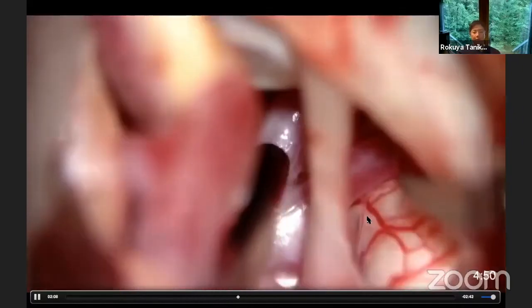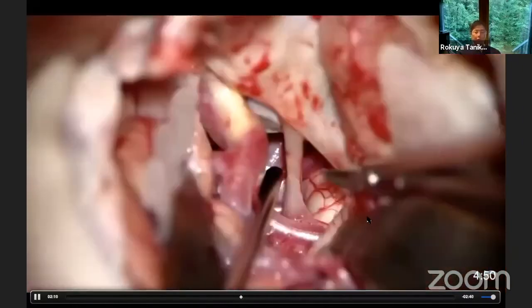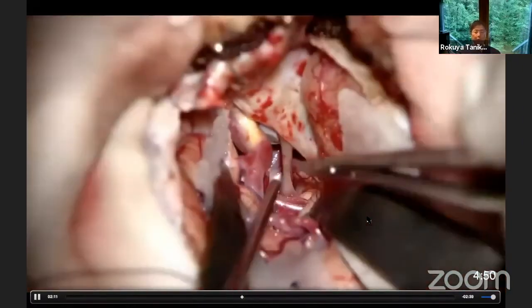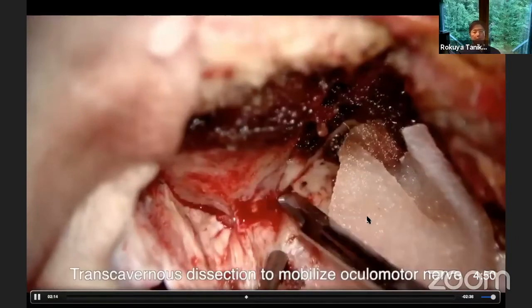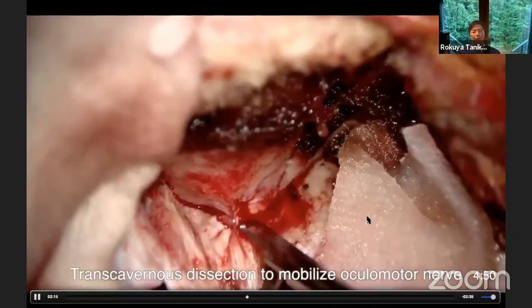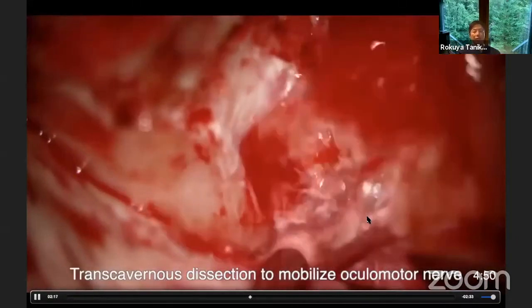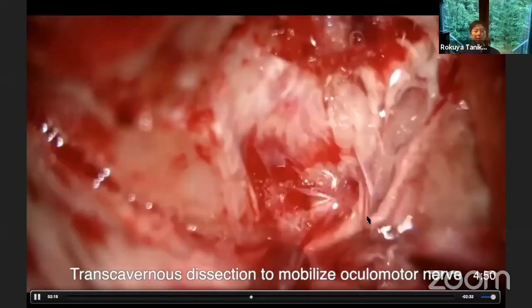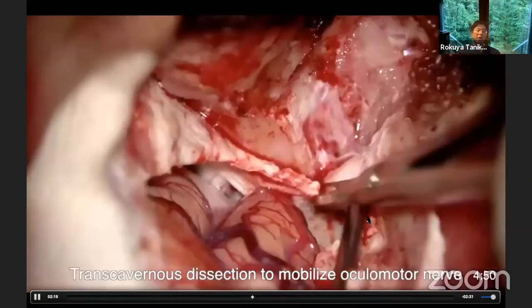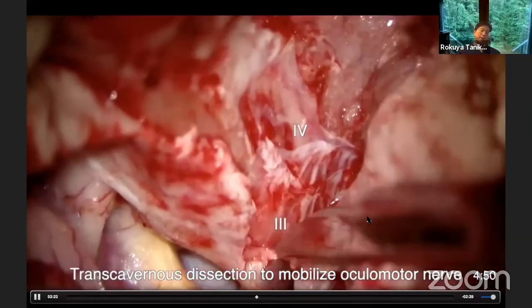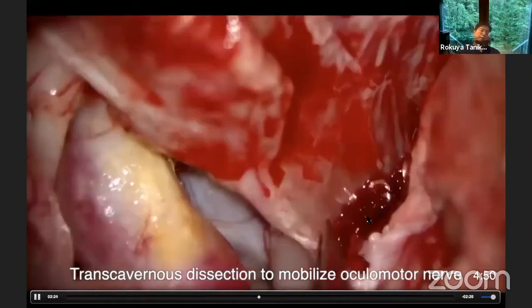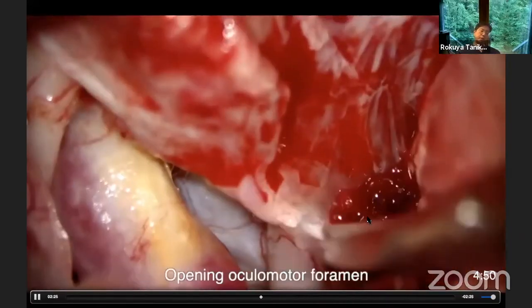Now I am securing the basilar trunk to put a temporary clip, but the operative field was too narrow to clip the aneurysm. So I decided to extend the operative field by performing the trans-cavernous approach.